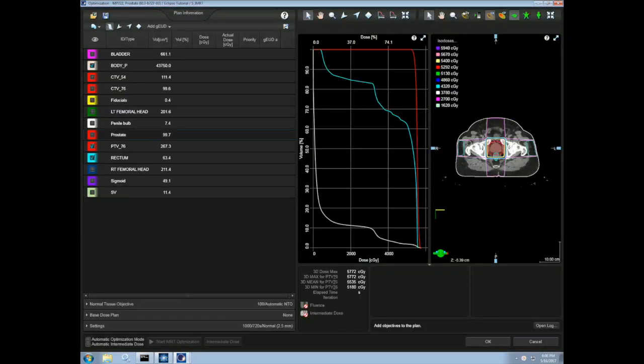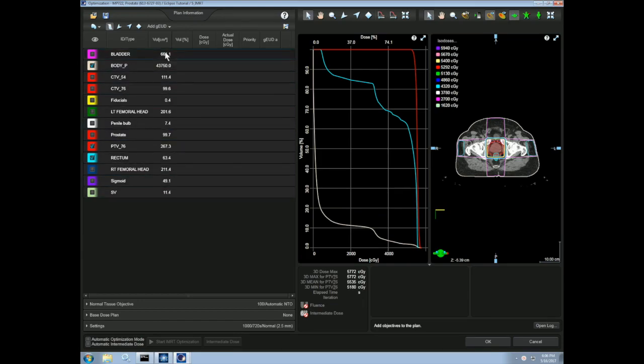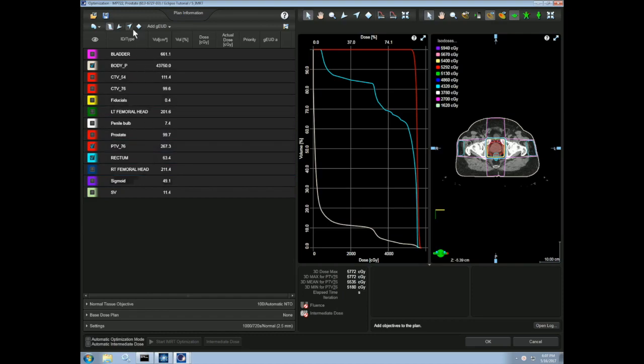We are now in the optimization interface, so let's discuss what we see. The most important part of the screen is a list of contours on the left. These are the structures that we'll be optimizing fluence for. When we optimize, we will choose between upper and lower constraints to reach our specified dose volume criteria.